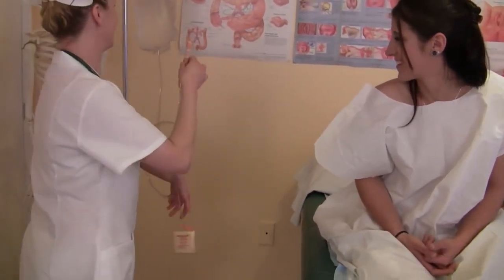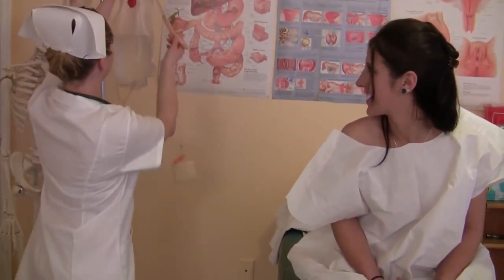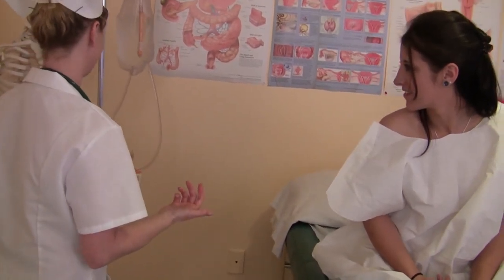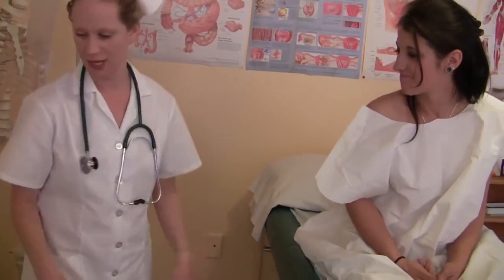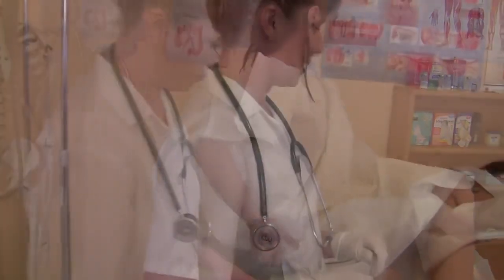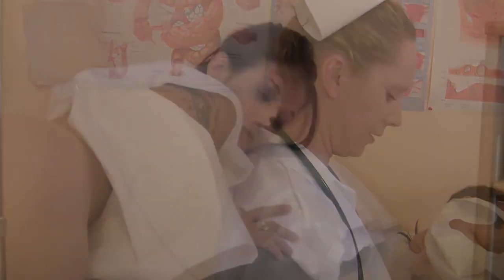That looks like a lot of water this time. It's not really though — it's going to drip a little bit. Alright, go ahead and lay down on your left side again. Let me know if you need me to stop or if you have any pain.